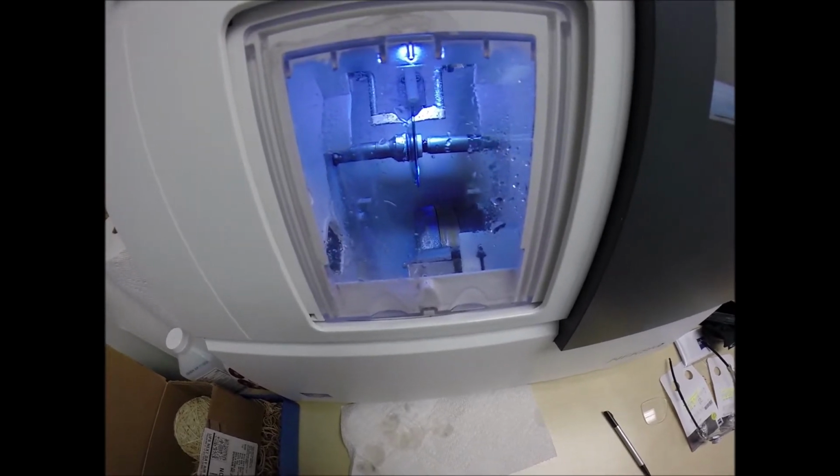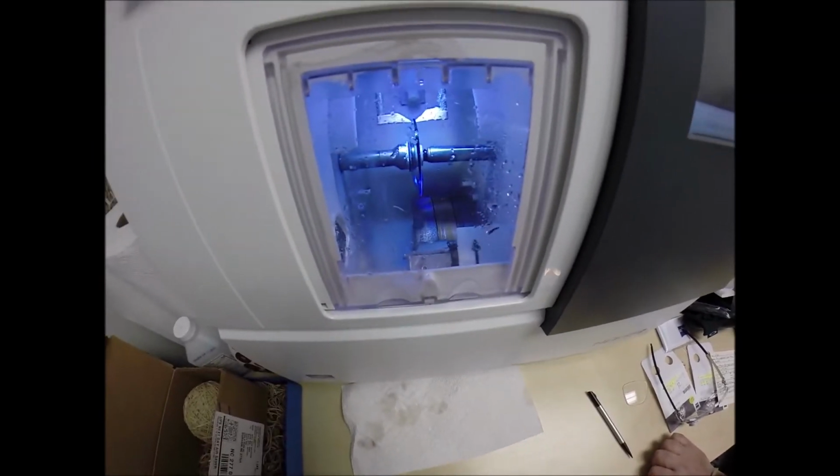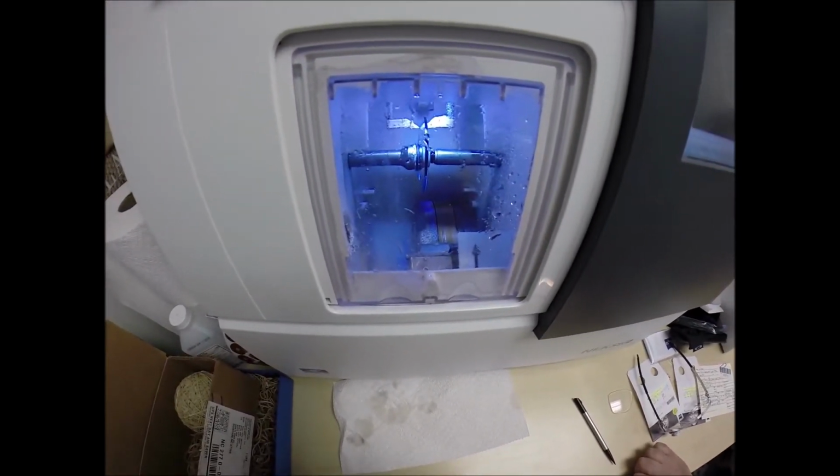So you can see as it's going around tracing the shape of the left lens this time, measuring the thickness of the lens to know where to place the bevel for the best cosmetic look possible.